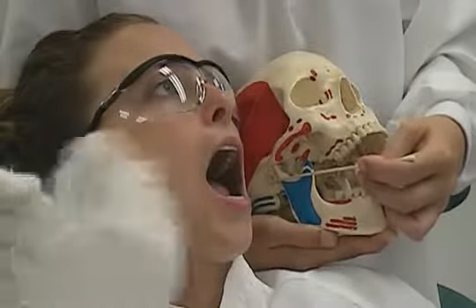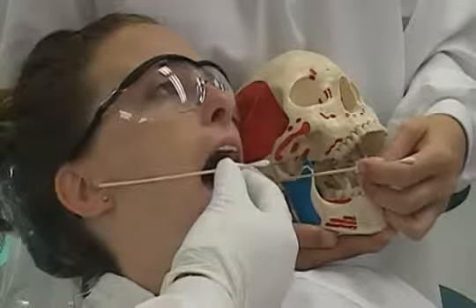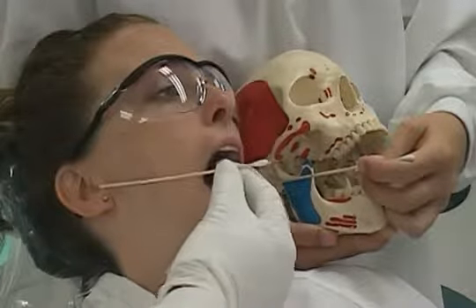Align the needle with the plane extending from the corner of the mouth to the intertragic notch on the side of injection. It should be parallel with the angle between the ear and the face.